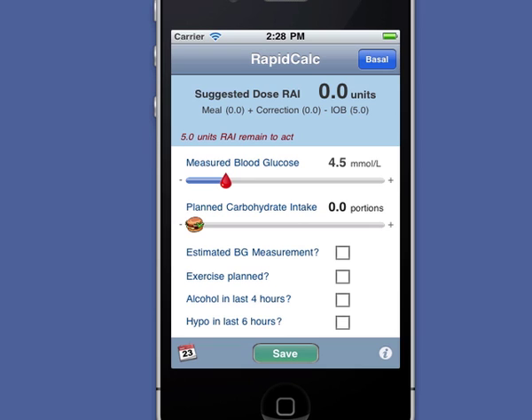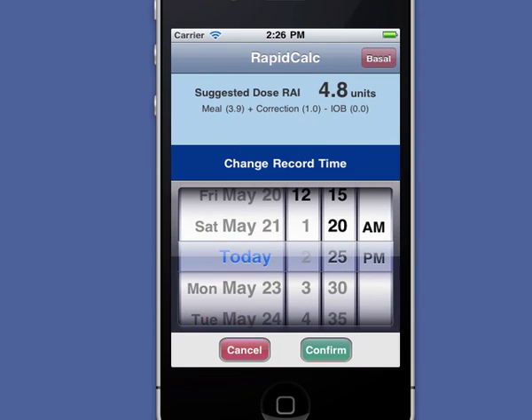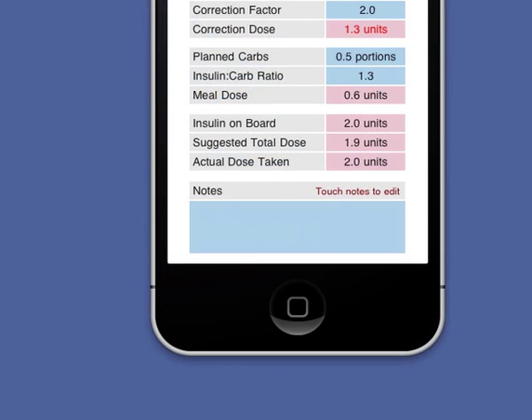If I dose without using RapidCalc, I can add the record later and backdate it to the correct time. I can even add or edit notes for any dose record at any time.